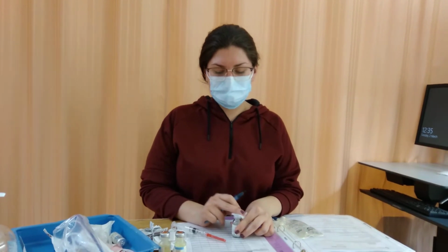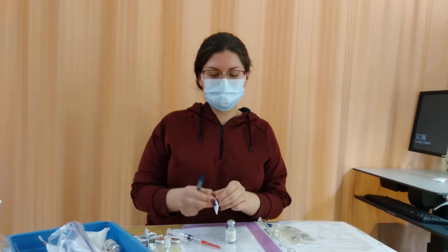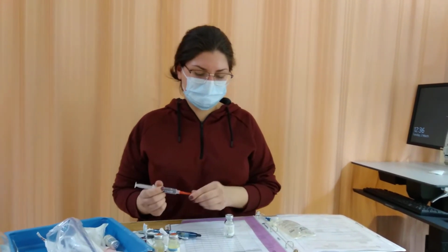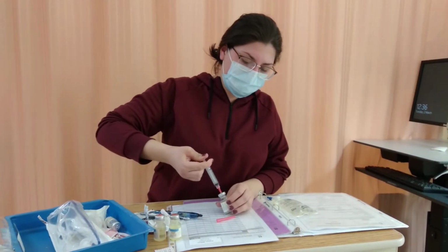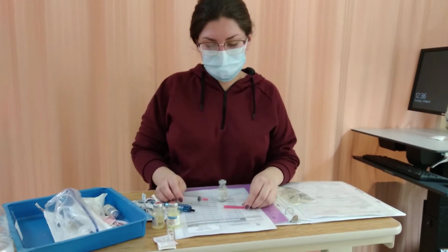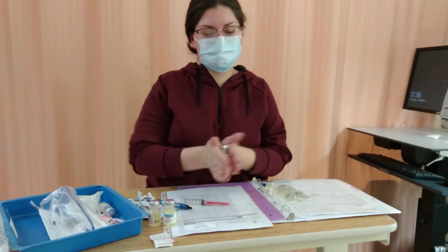Rest of the supplies will go in the patient's room. I would place my needle on some, then my swabs, secondary tubing, and then yeah, that's pretty much it. While going into the patient room, hand hygiene, doing a quick safety check, making sure that no signs of distress or hazard on the patient's face. Bed was in the low position.